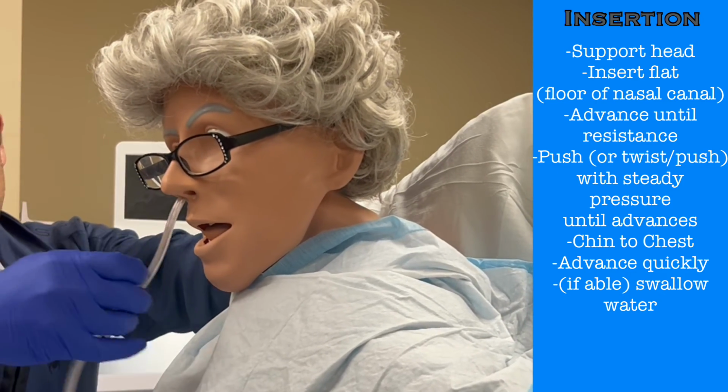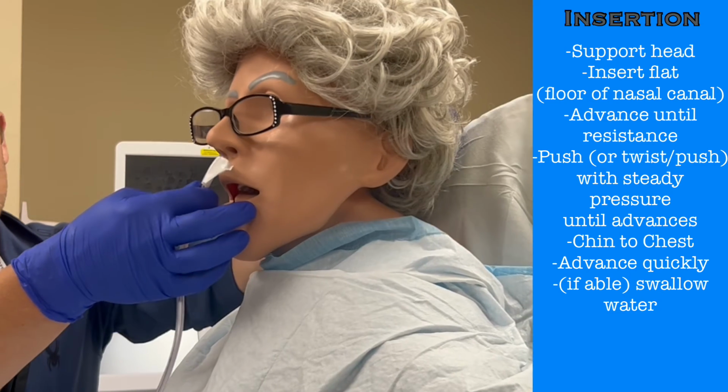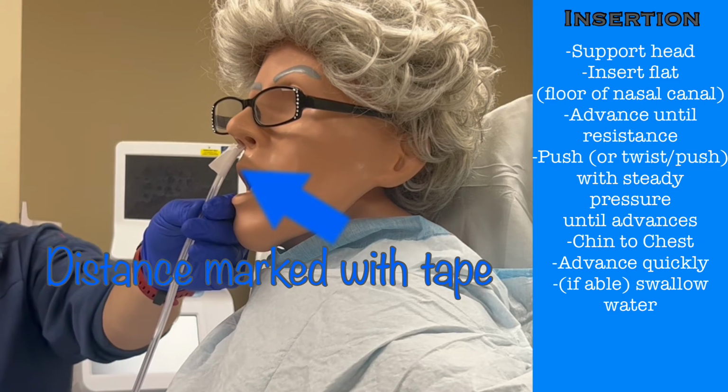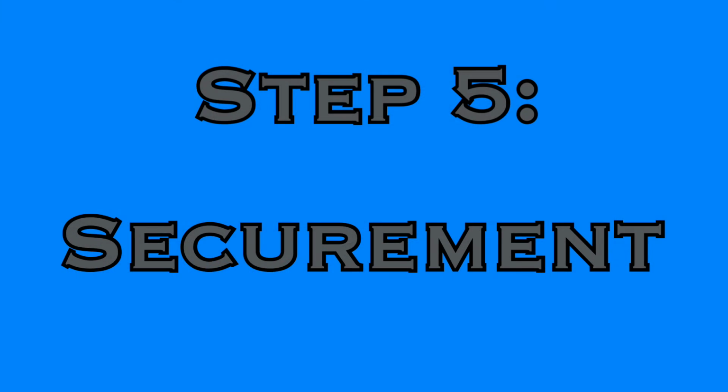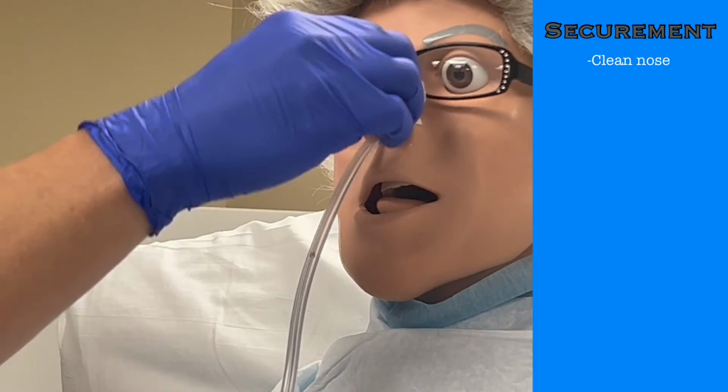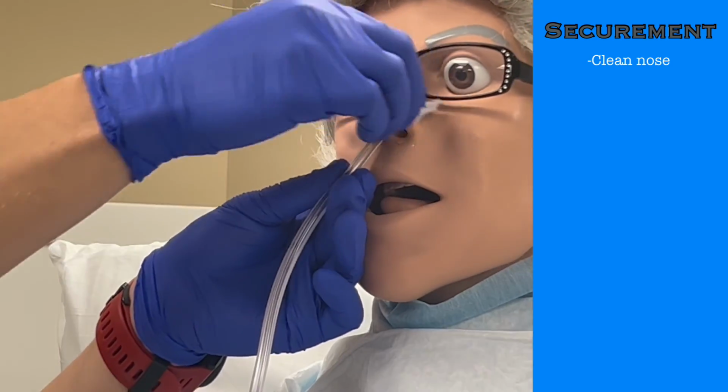They are swallowing water, but in essence, they are swallowing the tube into their stomach as well. When you reach the point you marked on the tube, stop the insertion. After inserting, you need to secure the NG tube in place. Clean the skin with an alcohol prep pad, and consider using a skin prep wipe as well.